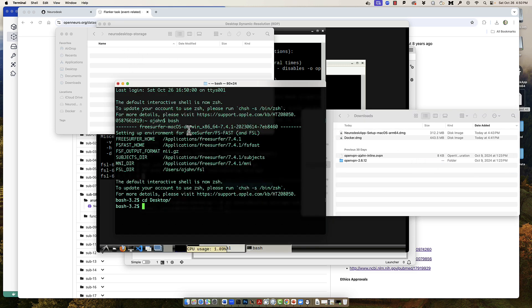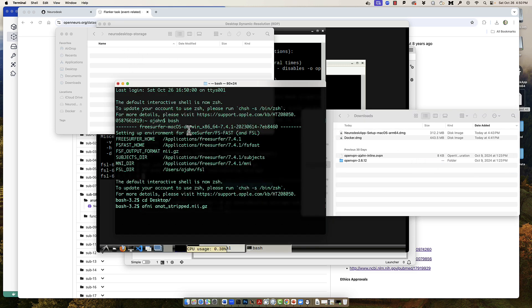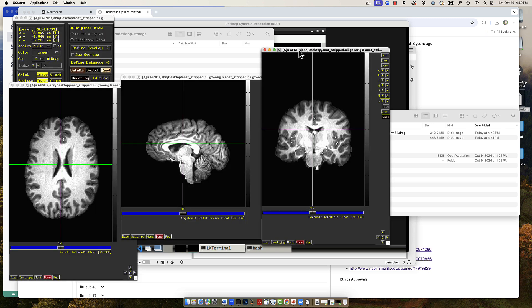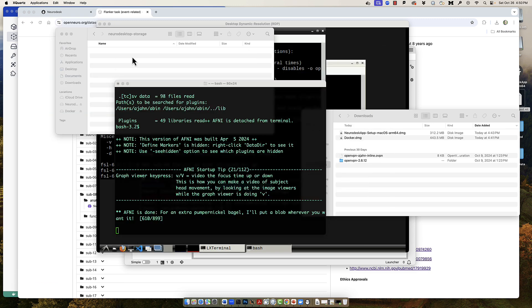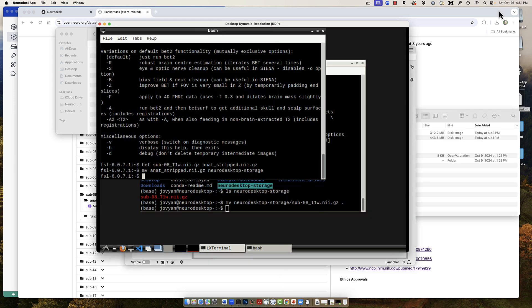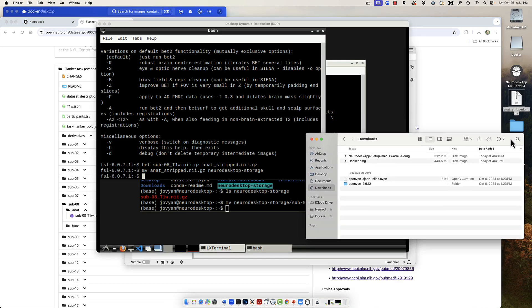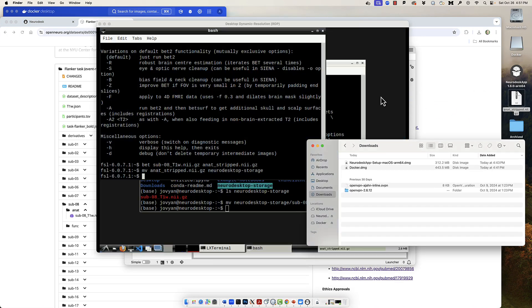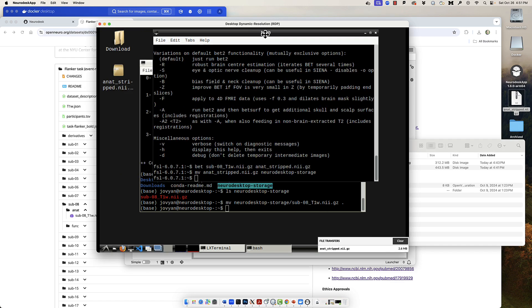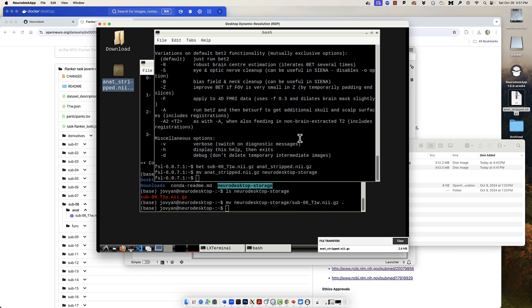I can then look at it with something like the AFNI graphical user interface, or whatever I want. I should also point out there are other methods to transfer files between your local machine and Neurodesk, such as dragging and dropping. You can see more details about this on the Neurodesk website.